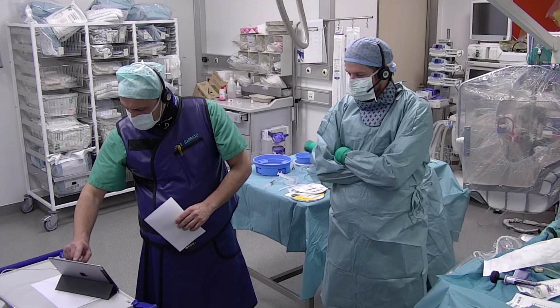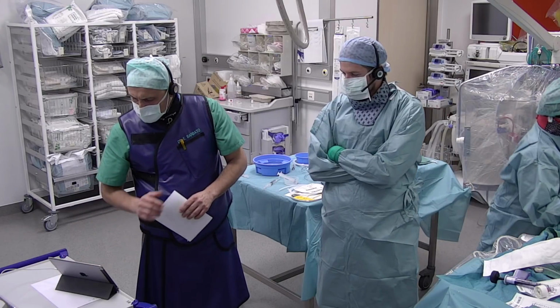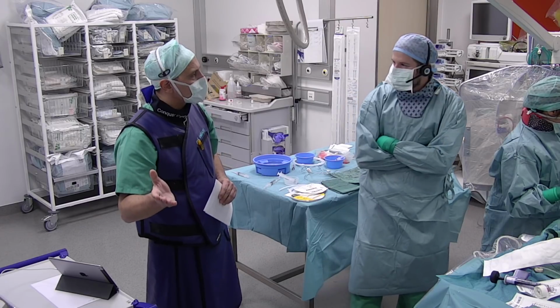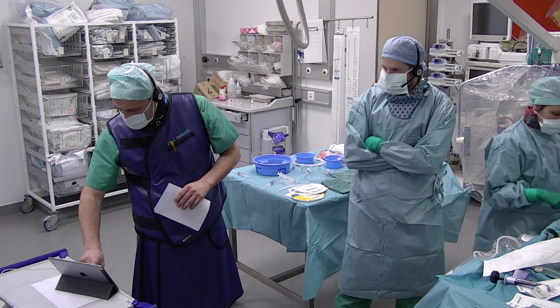Very quickly, there are still a lot of questions. Let's try to answer the most important one. What was the final FFR result? We missed it. It was 0.85. 0.85. So that one we saw.